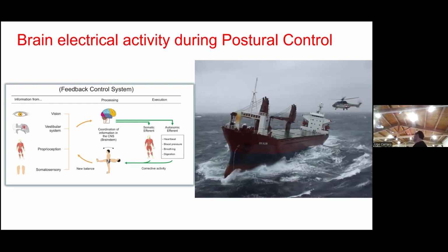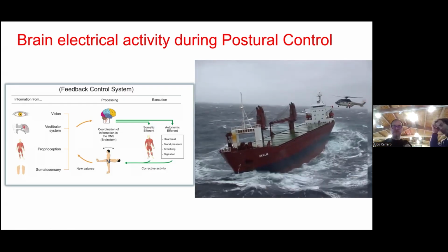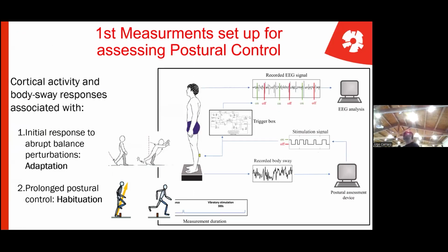Sorry. So we needed, of course, to study postural control and add biosignals, adding some measurement, to move beyond the state of the art. So normally postural control is measured with postural stability using a force platform. So you use a force platform that measures the center of pressure.